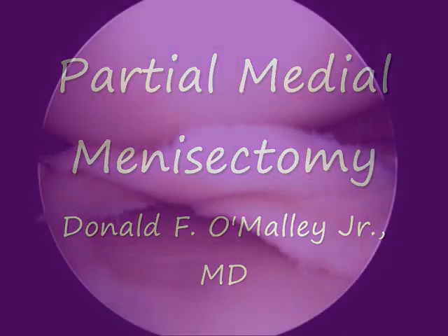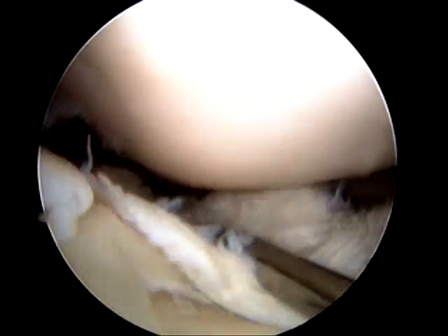Please enjoy my instructional video on knee arthroscopy and partial medial meniscectomy.